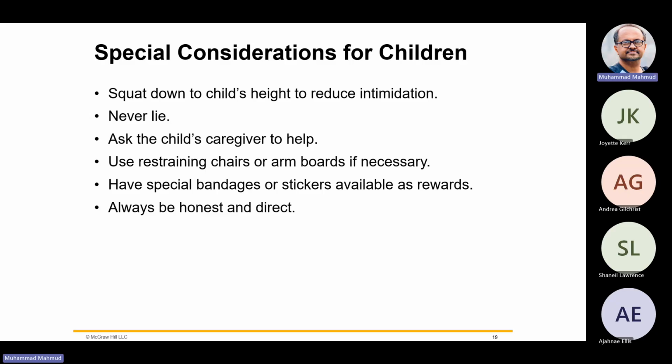Children may become even more anxious about a phlebotomy procedure than adults. Allow the child to view the needle for as short a time as possible to help reduce anxiety. Squat down to the child's height to reduce intimidation. Never lie. If the child asks whether it is painful, say yes, it will be a little bit painful. Ask the child's caregiver to help. Use a restraining chair or arm boards if necessary. Have special bandages or stickers available as rewards. And always be honest and direct.